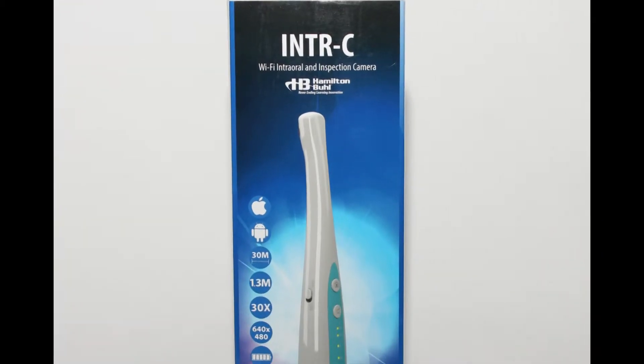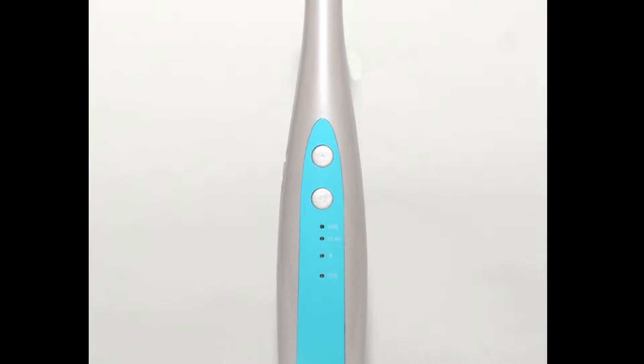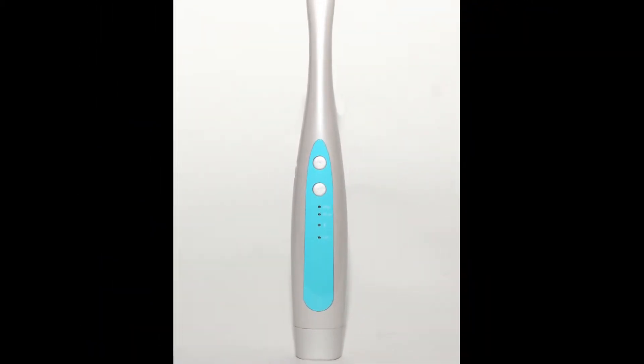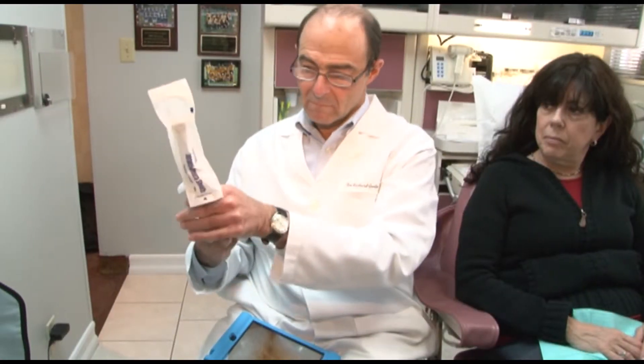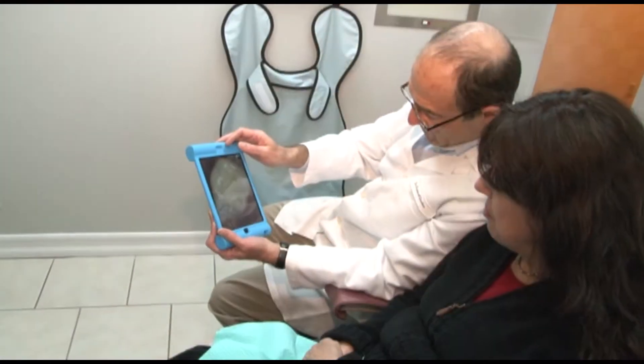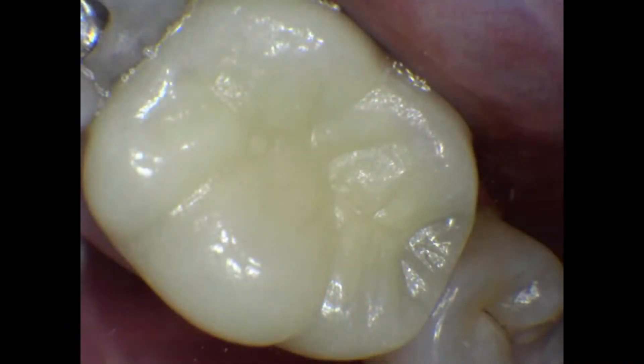The lightweight, portable, rechargeable, high-resolution digital camera is designed specifically for dental practices. The IOC camera is patient safe and comes with sanitary protective sleeves. It takes stills and video, and magnifies up to 30 times for clear, crisp, close-up images.